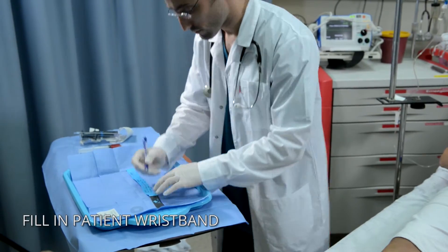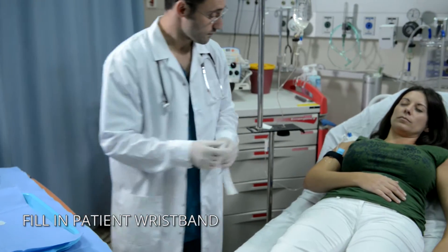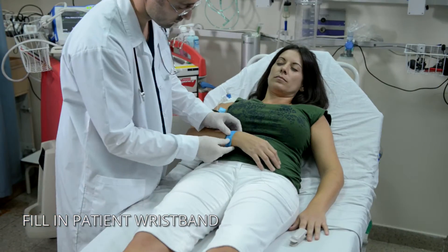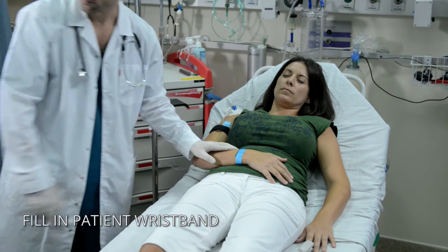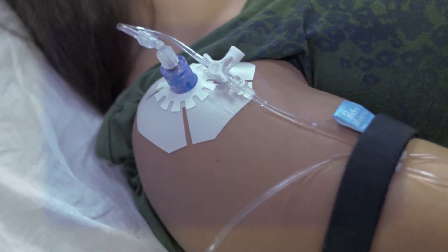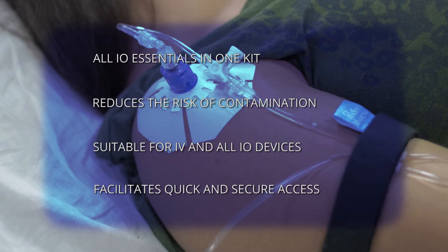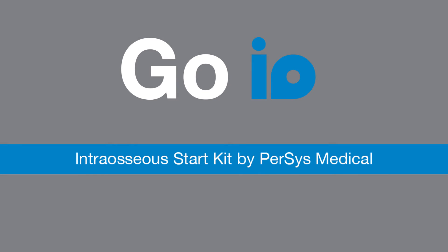End the procedure by filling out the details on the patient wristband and wrapping it around the patient's wrist. GO I.O. — intraosseous start kit by PerSys Medical.